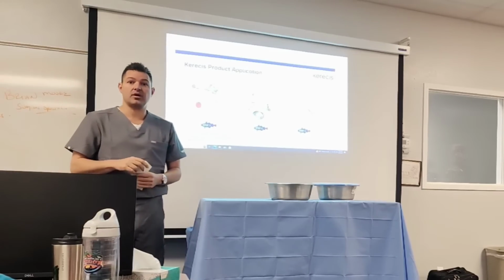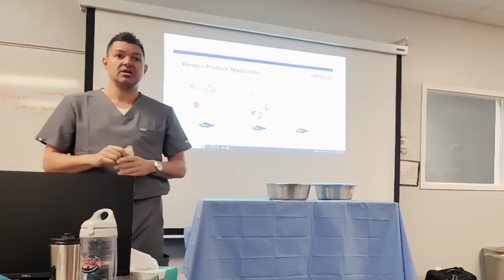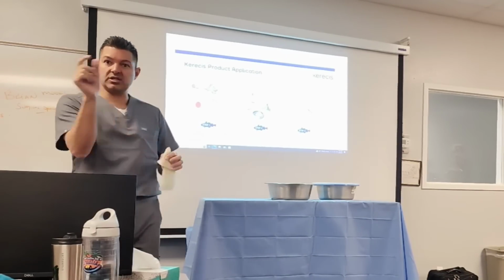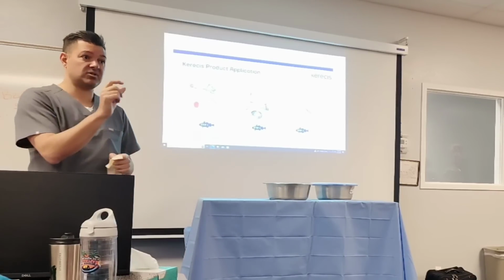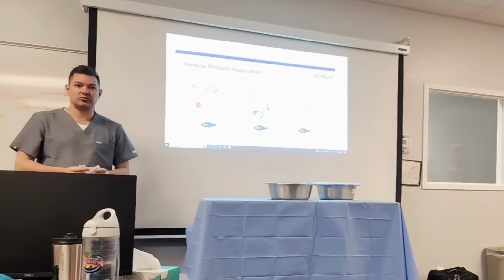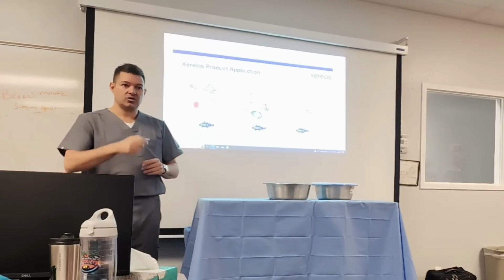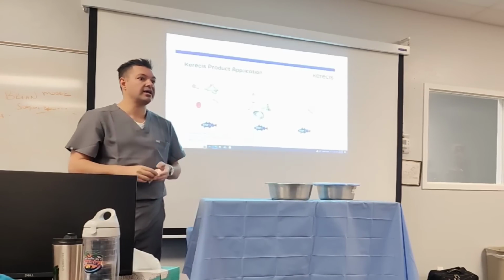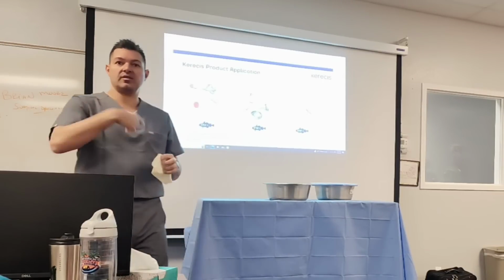Then after about 5 days or so with the patient, we'll come back and do a complete dressing change. High level, okay? I'm keeping this high level. There's a lot of attention to detail depending on the anatomical positioning and situation of that particular burn patient. But does that help give a little bit better of a visual in two different scenarios? So in the wound setting, you're going to do a lot of debridement, making sure there's a lot of blood supply, and then you apply the Kerecis, you apply an Adaptic, and then you have the Steri-Strips, and then the gauze over it.